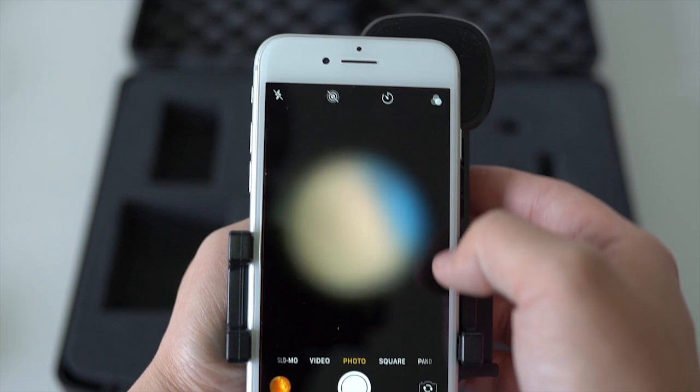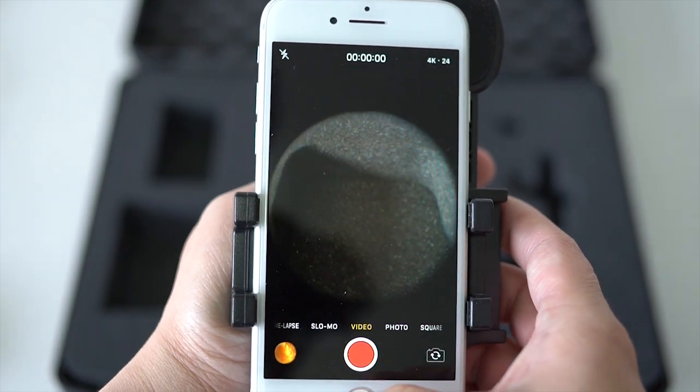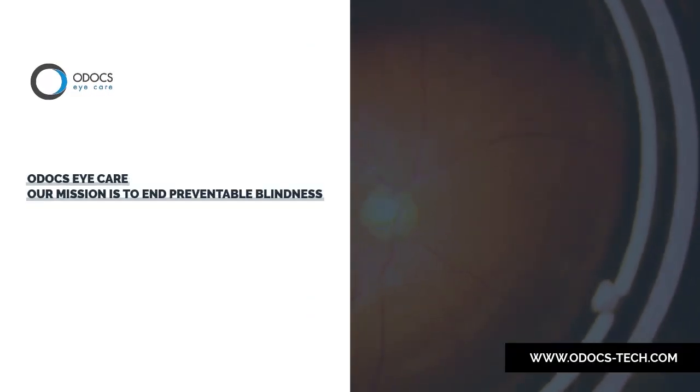You can record the findings using the phone's video or photo mode. We recommend a video with still images in between acquisition. When the battery is low, you can recharge it with the USB cable provided. Please visit odocs-tech.com for more information.